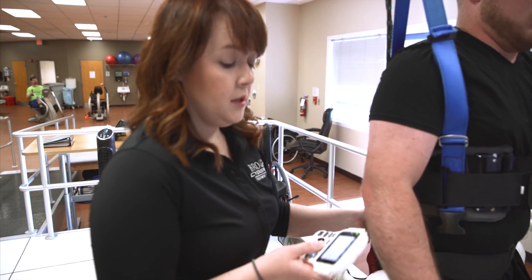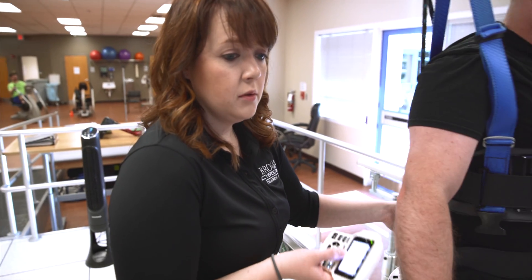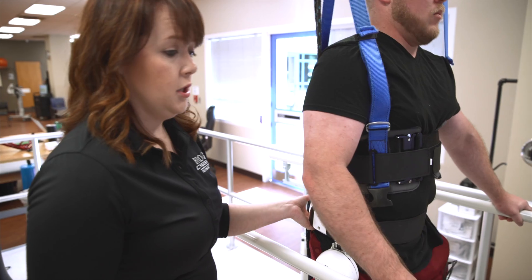When we increased speed to 0.8 miles per hour, we went from walk 4 to walk 5 — that's a different walk mode. It makes a difference as far as how quickly they're able to initiate the swing so it can initiate that step.